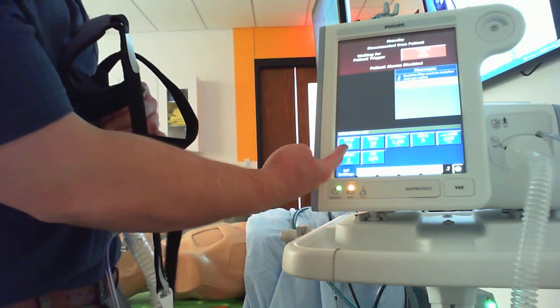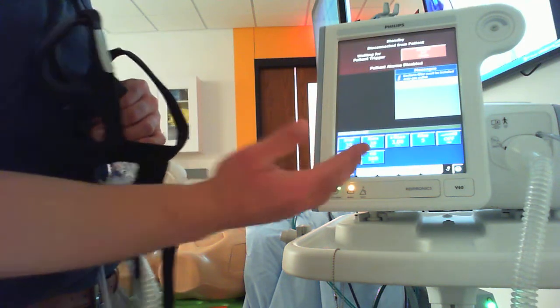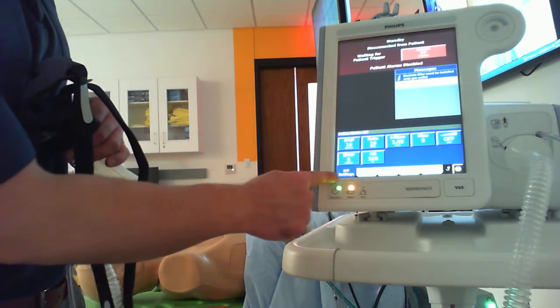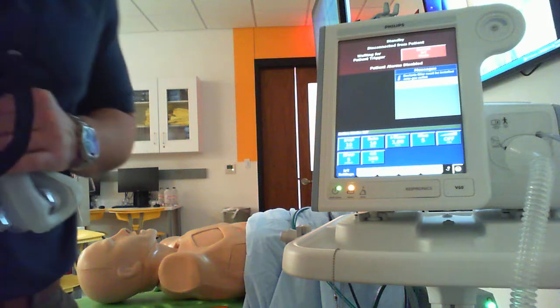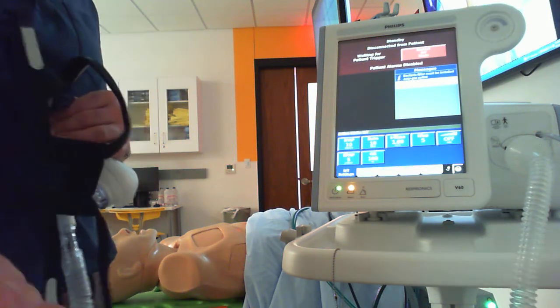So right now I'm going to start with an IPAP at 10, EPAP at 5. So 5 is support. We're going to start with 100% FiO2 here. Respiratory rate, this is a backup rate, so you want to make sure you're in the right mode. Most of the time you're going to be starting with spontaneous time, which gives us the ability to set a backup rate, but mainly spontaneous ventilation.